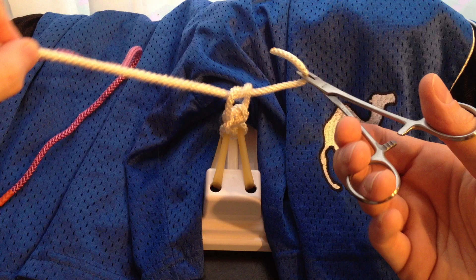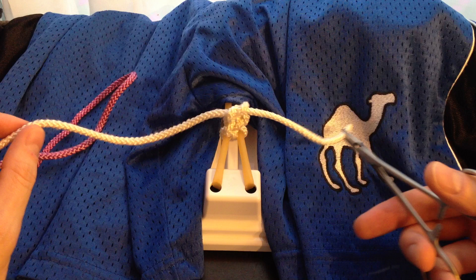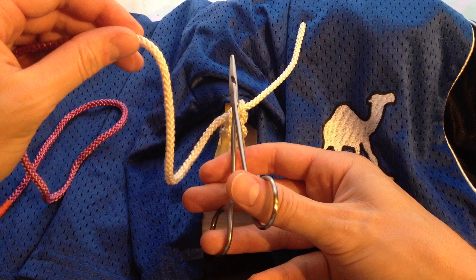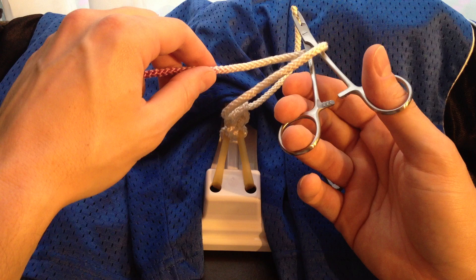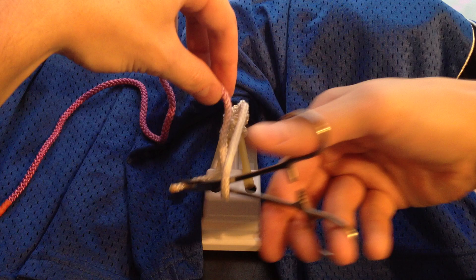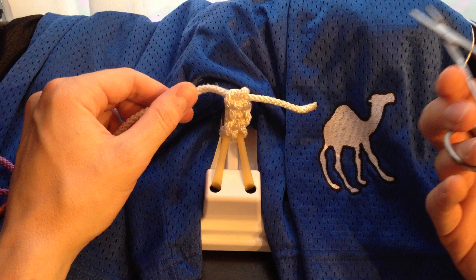If you've seen my other videos, you know how much I hate crossing my hands. So with the instrument tie, a way to avoid doing this is — instead of having your strings come out to the left and right — you can torque them. You can still start with your needle driver parallel to the incision, form a loop, and when you grab it, you're still going to pull it to the opposite side. This time, we're going from the top right down to the bottom left. Same thing: down the middle, loop it once, grab the free end, bottom left to top right. It's a little harder to see since the string is all white, but we are still tying square knots.